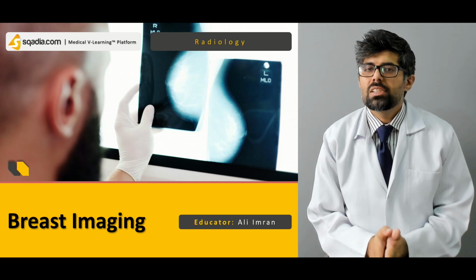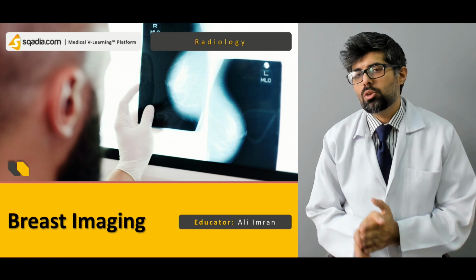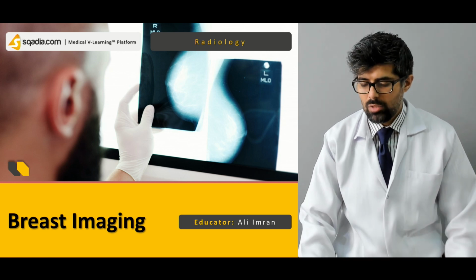The topic of today's lecture is breast imaging. I'm your educator, Dr. Ali Imran, and let's get on with it.